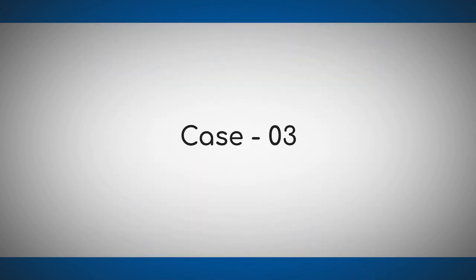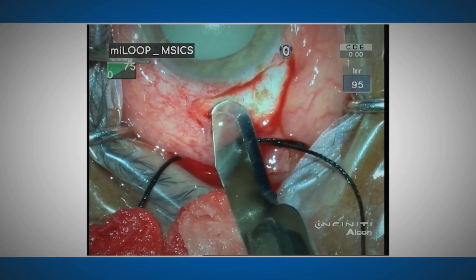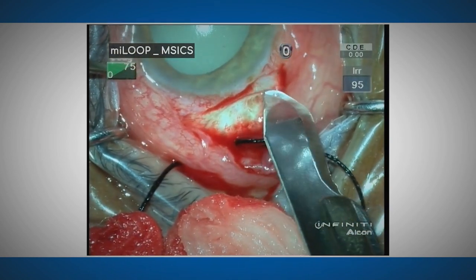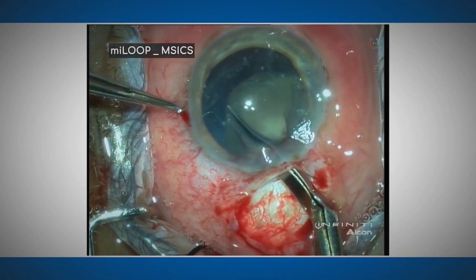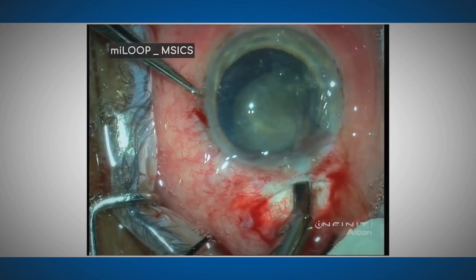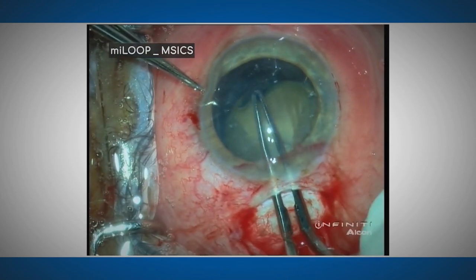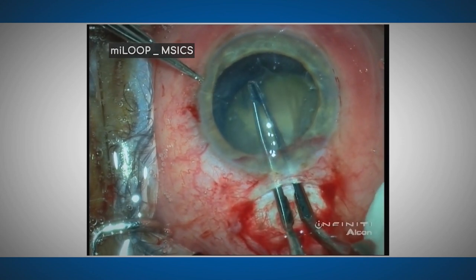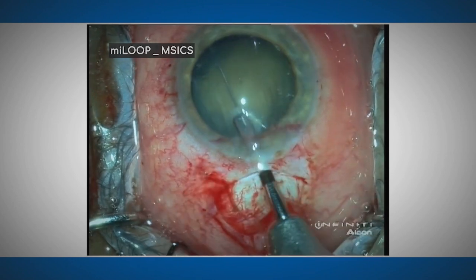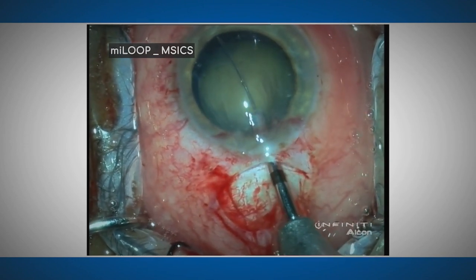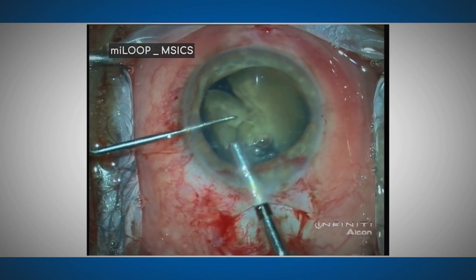Case number three is a case of phacolytic glaucoma in which weak zonules can result in intraoperative complications. Here, a capsulotomy was performed using an envelope technique, and the floating nucleus was divided with the My Loop without any damage to the zonules. This suggests that the My Loop can be zonule friendly.